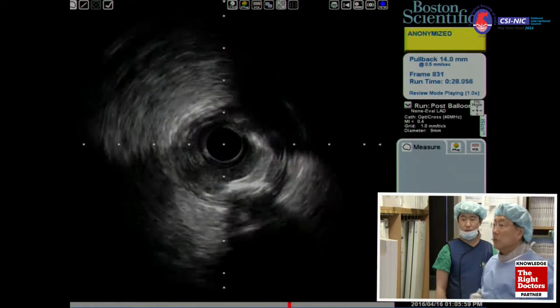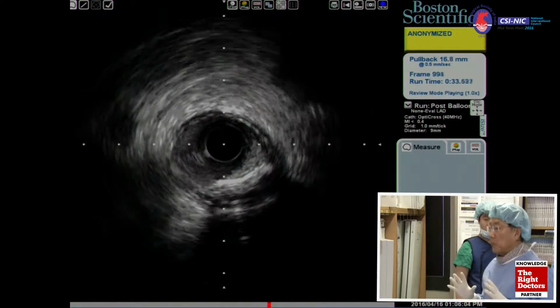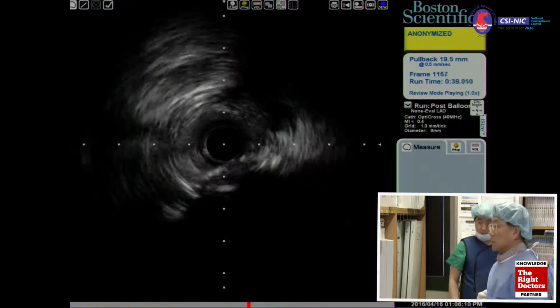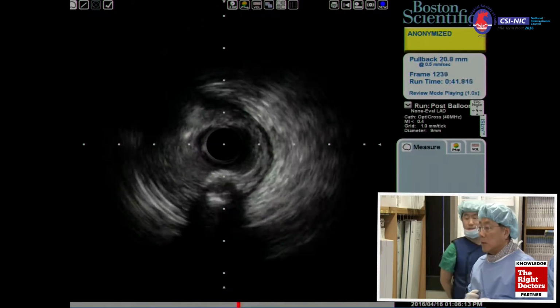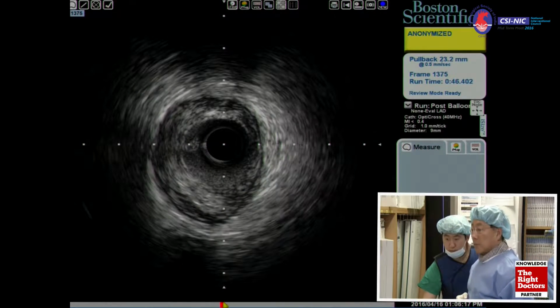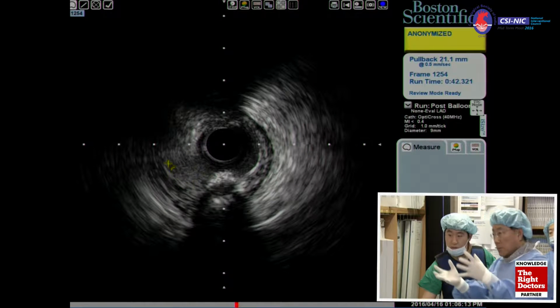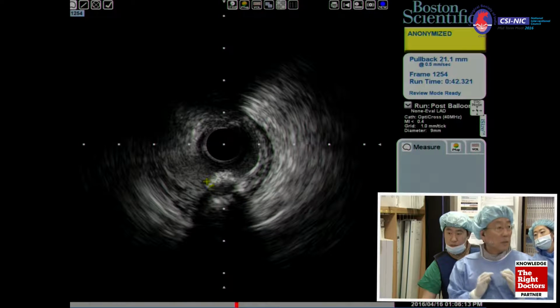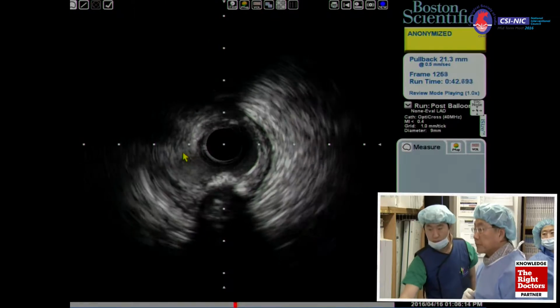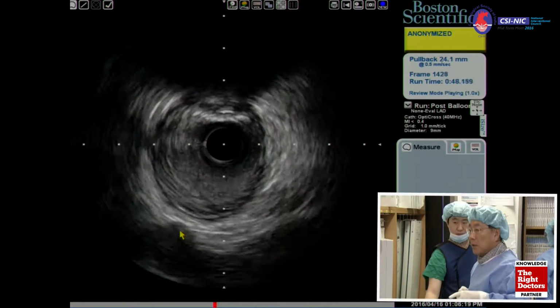We have a lot of information from the IVUS. Because it's almost the main bifurcation disease intervention, we prefer IVUS. Okay, big diagonal branch coming in from the 1 o'clock. There's a big vessel, LAD. Oh, some ruptures here, right? Stop. Could you see that? 1 or 2 back. Okay, that one. There's a 6 o'clock, 7 o'clock, very big rupture. What about the clinical manifestation? This is unstable, vulnerable plaque here. Okay, go ahead. And some organized thrombus from 6 to 9 o'clock here.